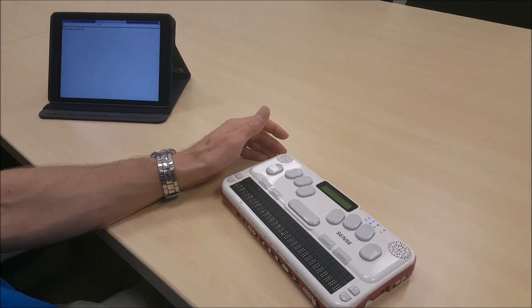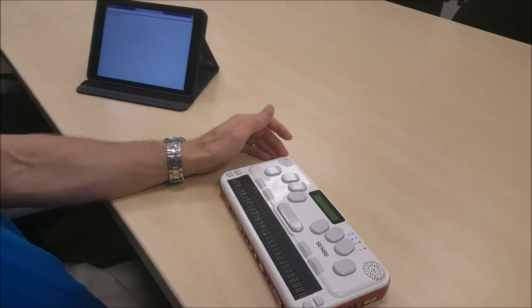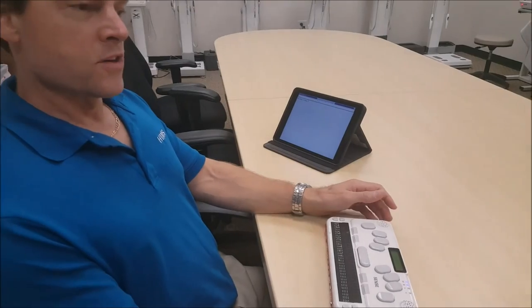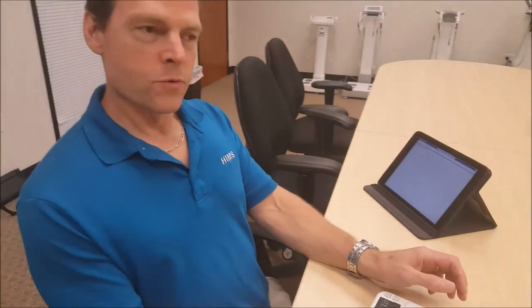And that's how one-handed mode works on the BrailleSense models. This will also work in terminal for screen reader so that if you are using the BrailleSense as a Braille display with your iOS device or your computer, one-handed mode stays in effect. Thank you for tuning in to our tutorial video on the BrailleSense and one-handed mode.